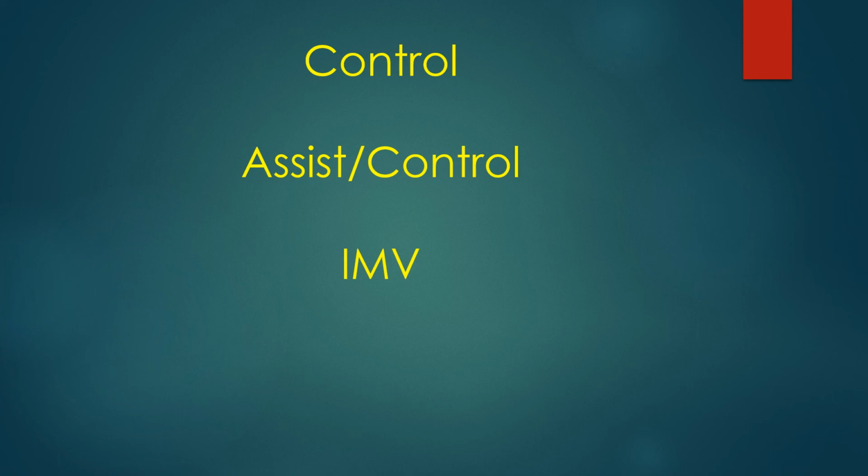The patient will make an inspiratory effort, and since his ET tube is connected to the ventilator tubing, and that's a closed circuit, when he made an inspiratory effort, the pressure would drop in the circuit, and that's what the machine would sense to give him the breath when he wanted it, not necessarily because of the timing set by the respiratory rate.